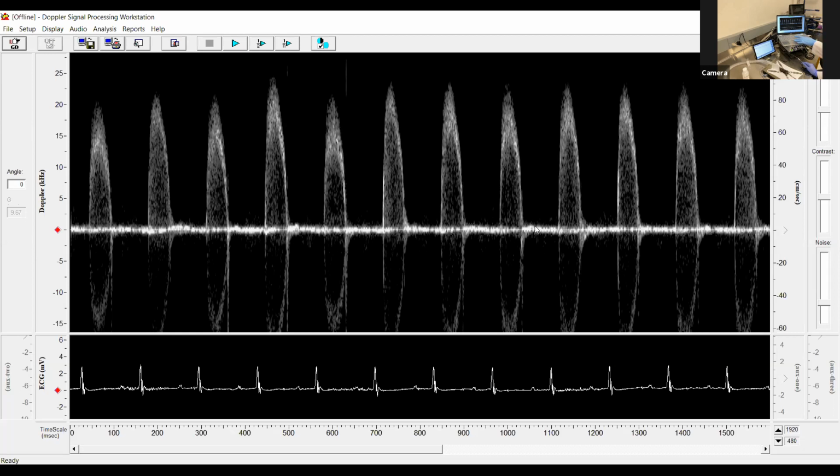The little tick that you're seeing down here after systole is the closure of the valve. As the valve closes, it pulls back a little bit of blood with it, and we can see that. We use that as a landmark to know that we're always measuring in the same location within the animal, so we can be very reproducible in the images that we're taking.